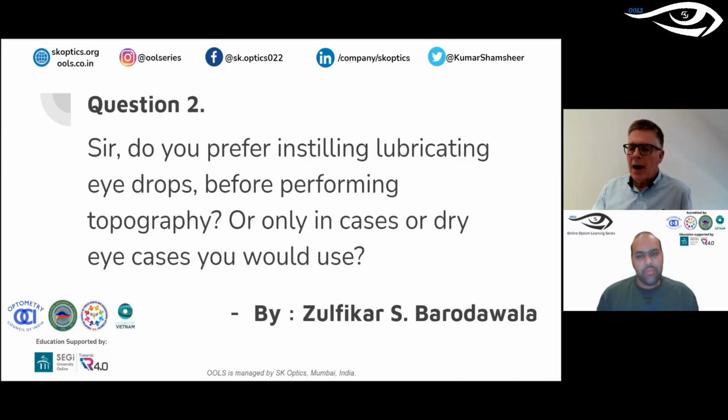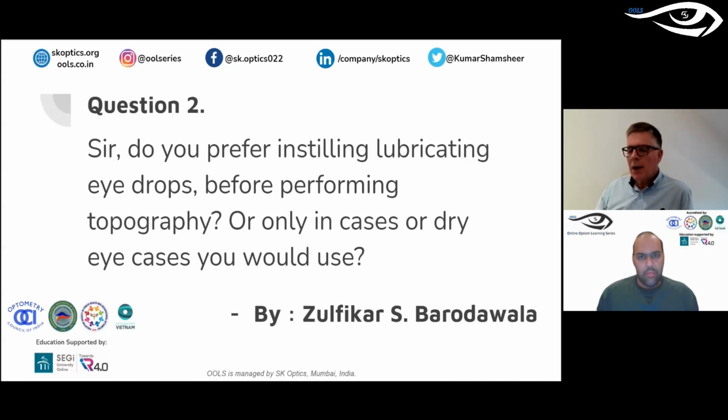But in cases of dry eye, I think the topographer and the osmolarity are the 2 fundamental tests that I go by, because they're visual. The patient can see exactly what's happening. A patient with dry eye has comfort issues and visual issues, and the topographer that I use has a little graph. It has an average topography, but it has a graph, so we'll take the actual as well. And if there's quite a large dioptric difference per blink, that will indicate that there's visual instability.